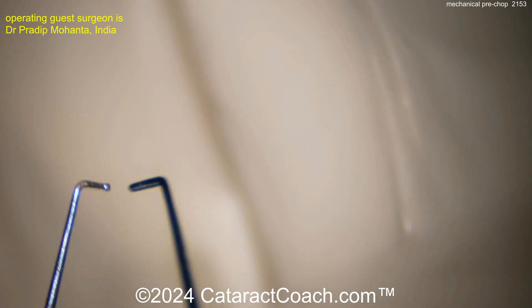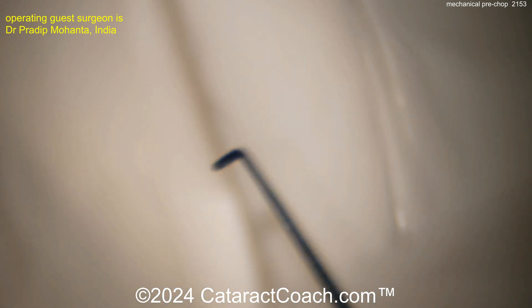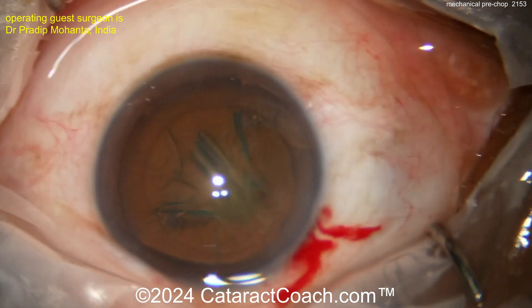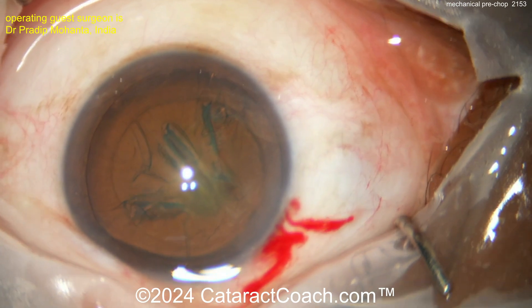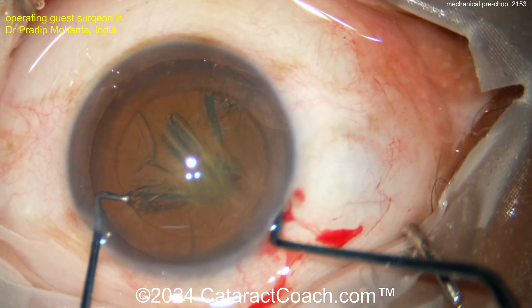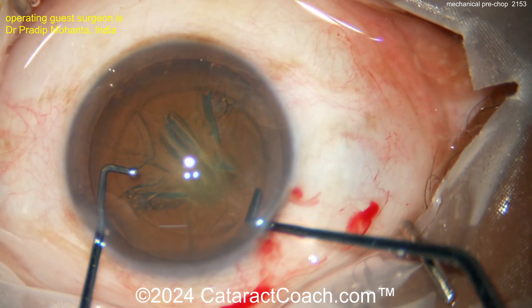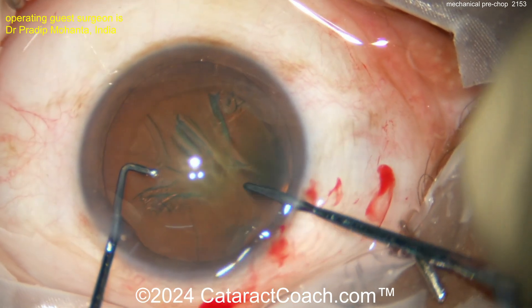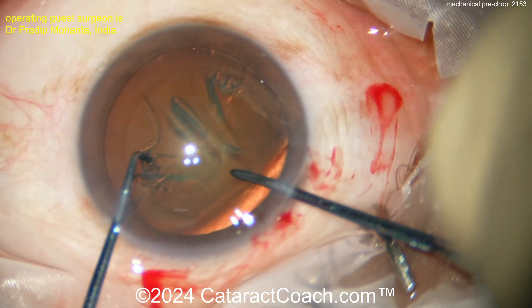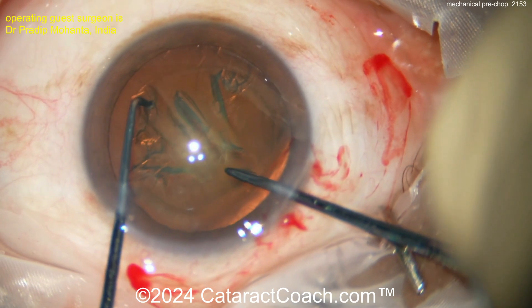You pre-chop the nucleus — meaning you do it before putting the phaco probe in the eye. You may have seen other pre-choppers like Akahoshi's, or even chopping with just a cannula and a chopper. It doesn't really matter what instruments you use — it's the technique. Here, the chopper is placed just sub-incisionally, just inside the capsulorhexis.